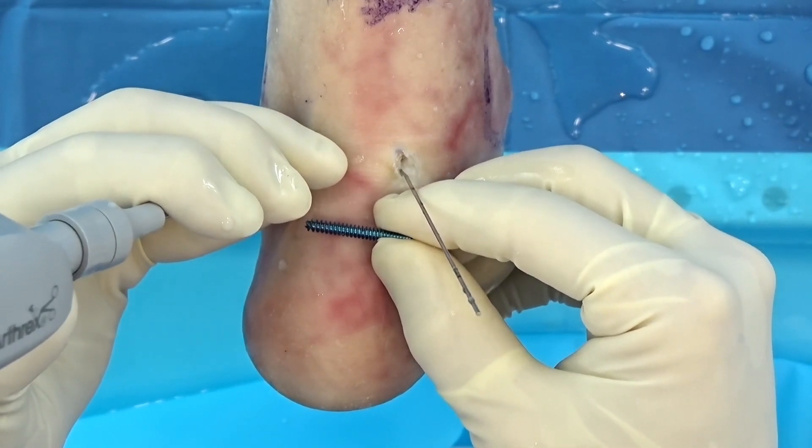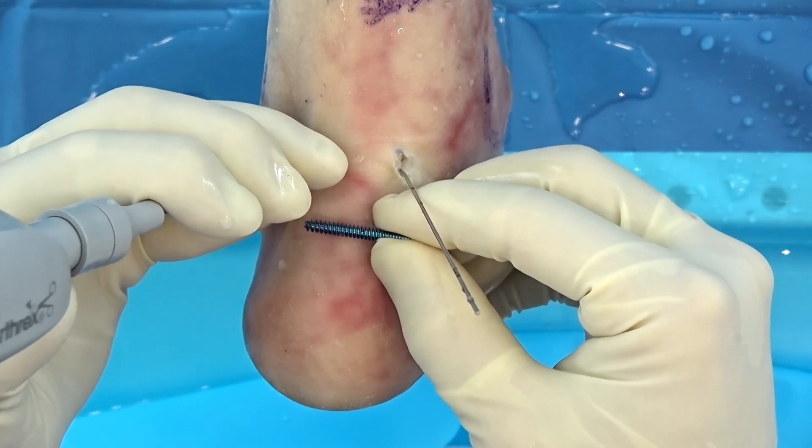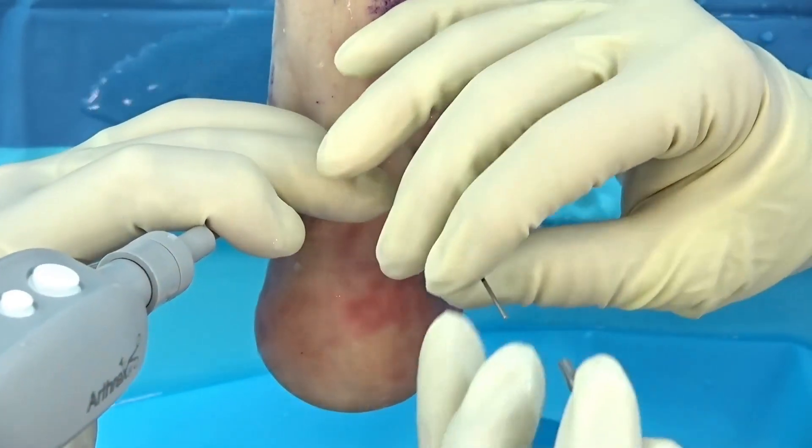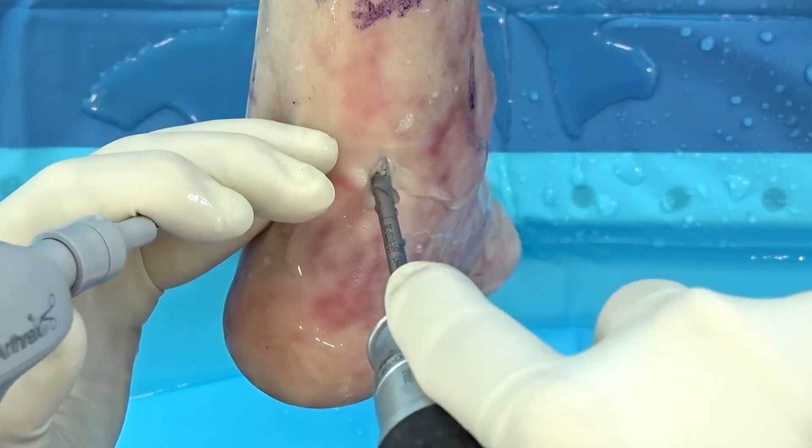It's fully threaded and compression, so not only is it going to compress my talus fracture, it's going to prevent long-term collapse. For me this is a perfect screw for this indication. You can slide it right down in through the back just like that. With direct visualization we can talk about: is your screw proud? Is it sticking out? Is it impinging on the cartilage? Then we switch to hand, bring your screwdriver right up. These screws have great bite. When you're done, you pull it and you can just visualize — that's the beauty of doing this through the Nano. It allows me to visualize the subtalar joint, the tibiotalar joint, and do some advanced procedures that may otherwise be very difficult. Screws in the talus from posterior to anterior are actually the strongest, so we're also maximizing biomechanical force.